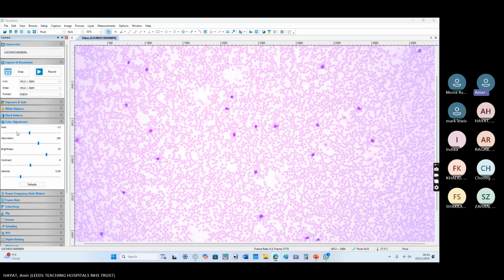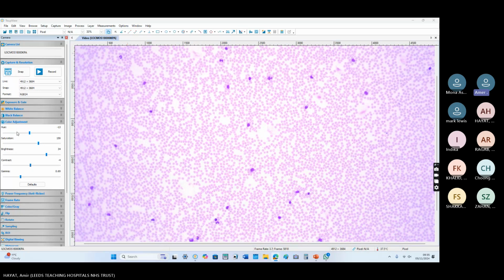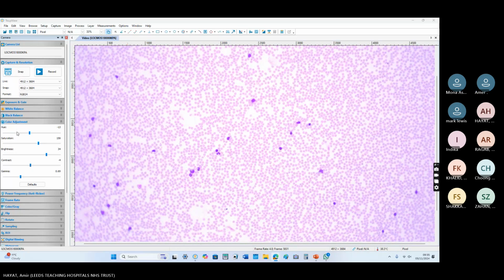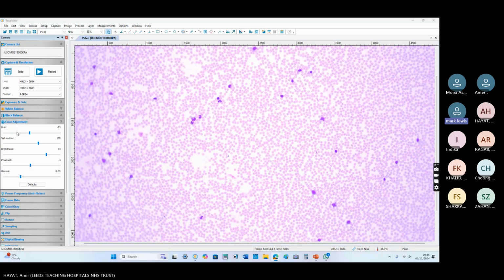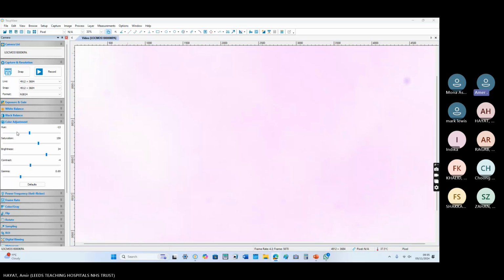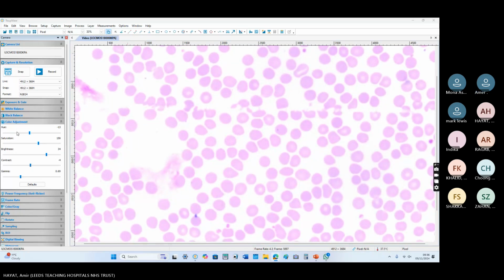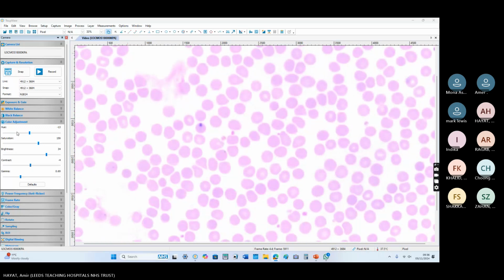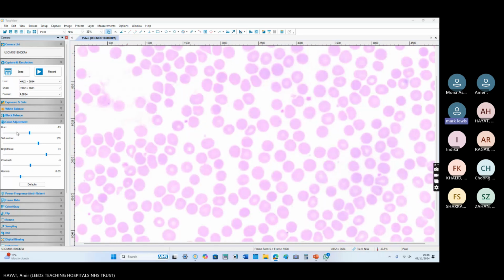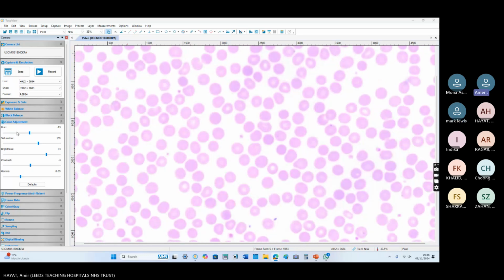Okay. So this was the general overview. Do we have a volunteer to chip in? Leukocytosis. Yeah. Seems to be a few monocytes about, I think. Okay, I will make it to power 50, to make things more clear. Looks a bit thrombocytopenic, maybe. Yes, platelet count is low.